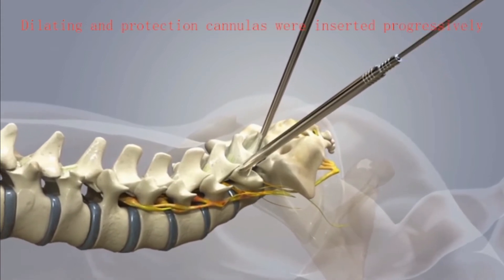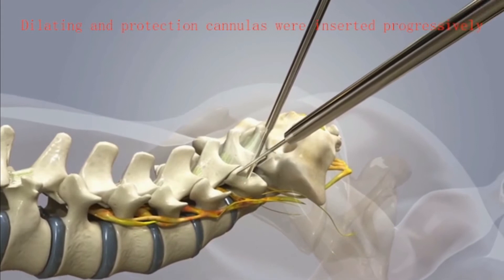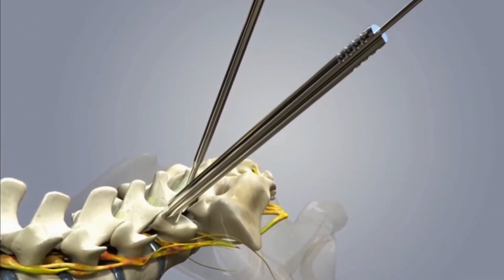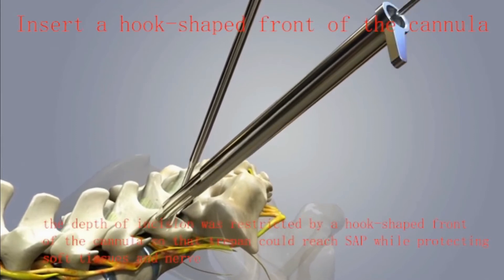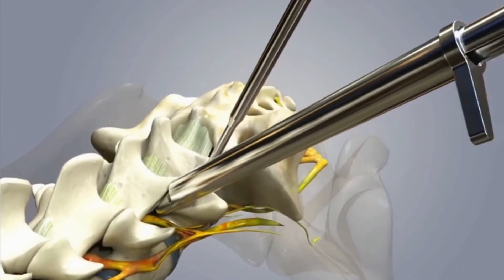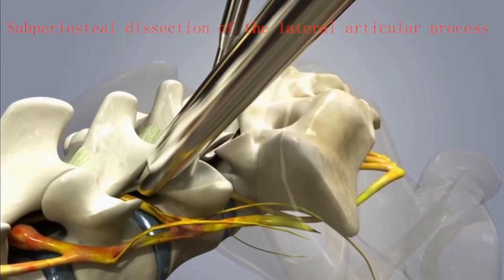Then dilating and protection cannulas were inserted progressively. The depth of incision was restricted by the hook-shaped front of the cannula so that the trephine could reach the superior articular process while protecting soft tissues and nerve.